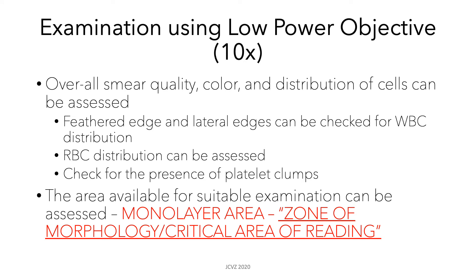Using the low power objective, you can assess overall smear quality, color, and distribution of cells. For example, on the feathered edge and lateral edges, you can check for WBC distribution. You can also see if your RBCs are properly distributed and not clumped, and check if there are any platelet clumps using the low power objective.